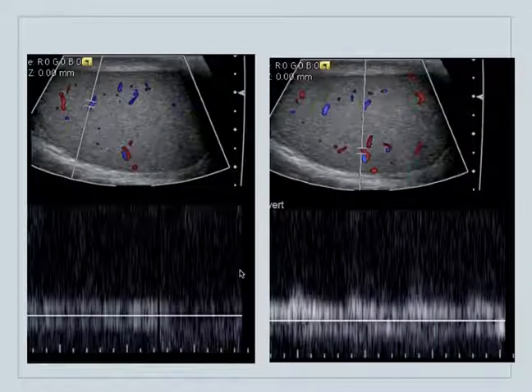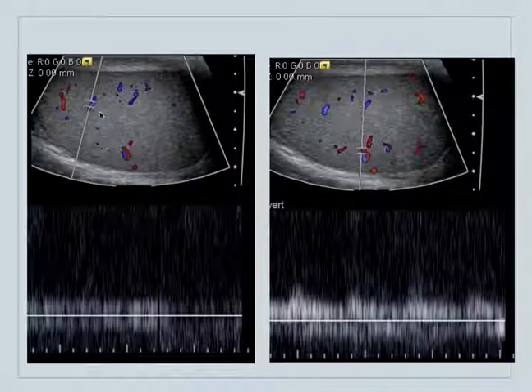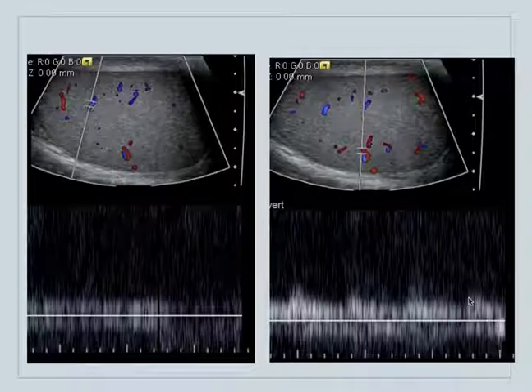This is an example of color flow Doppler. The blue is flow in one direction, and the red is flow in another direction — in this case, the red is arterial and the blue is venous. This is a combination of both color flow and pulse wave Doppler. Here's the sampling gate over the blue, which has a venous waveform, and over the red, which has more of a pulsatile pattern.